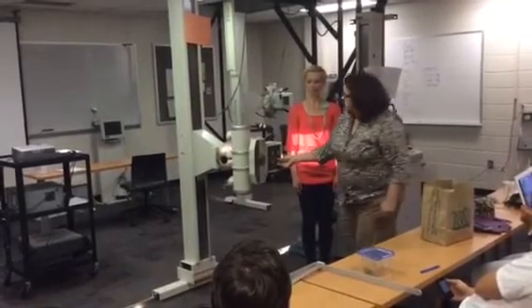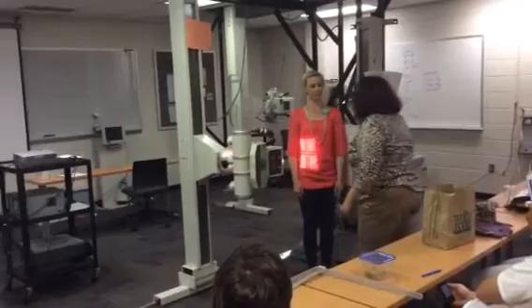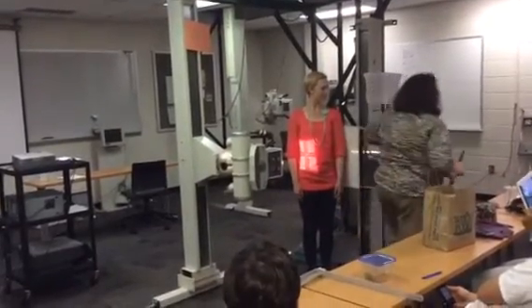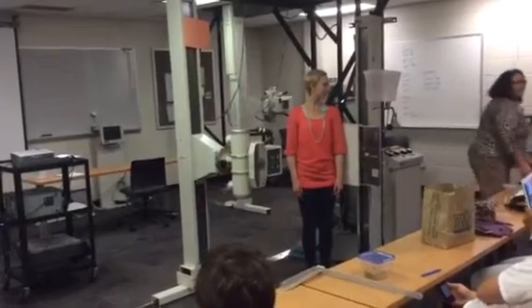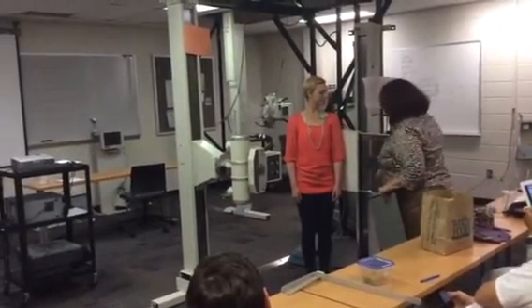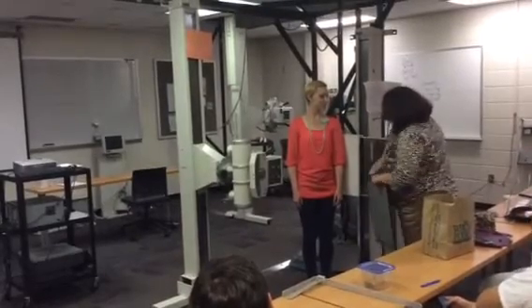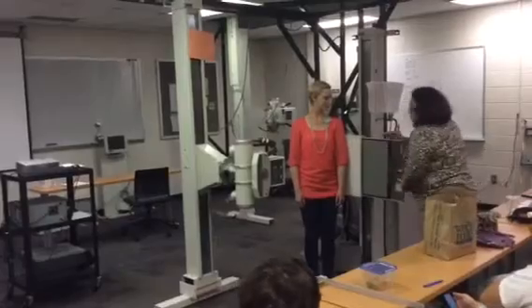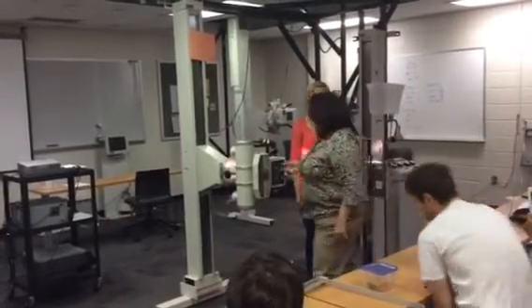Okay, I'm going to collimate. I've got a 10 by 12 in here, and I could use a 10 by 12 and then collimate 9 by 11, but the lab manual tells you to use 14 by 17, so that's what I'm going to do. And then I'm going to collimate 11 by 14.